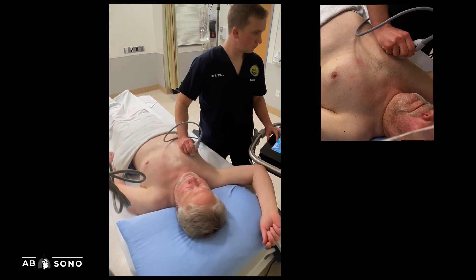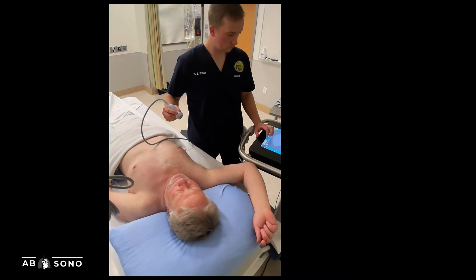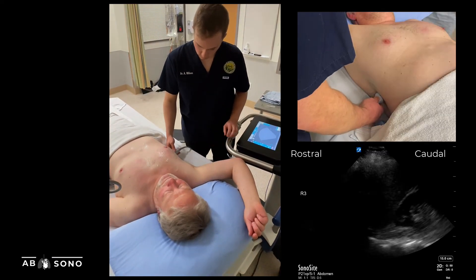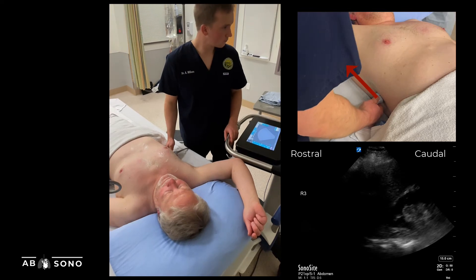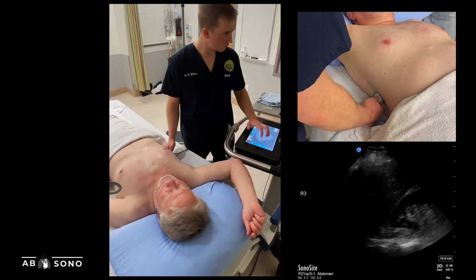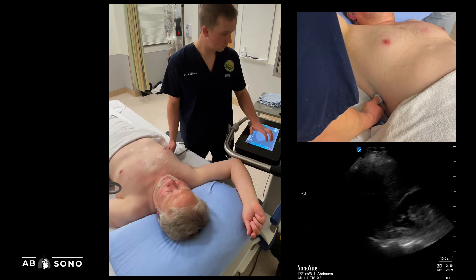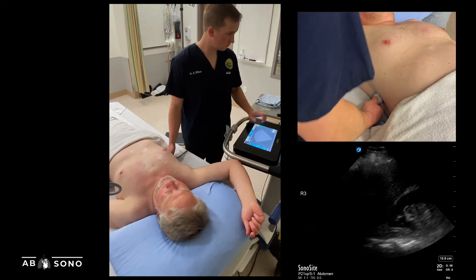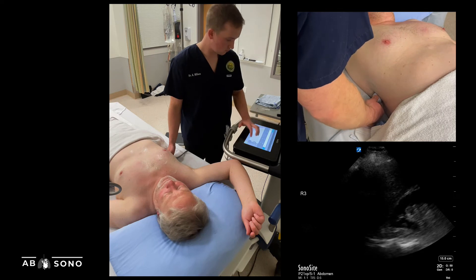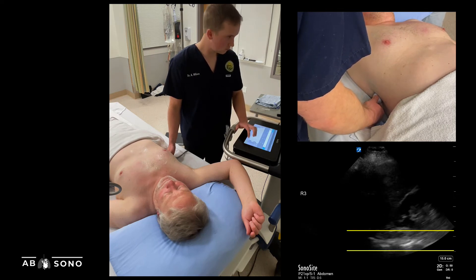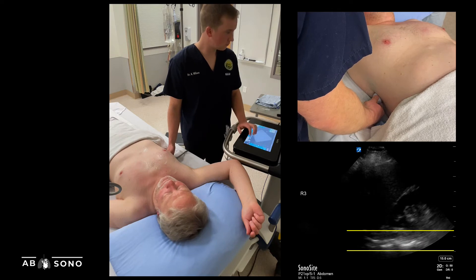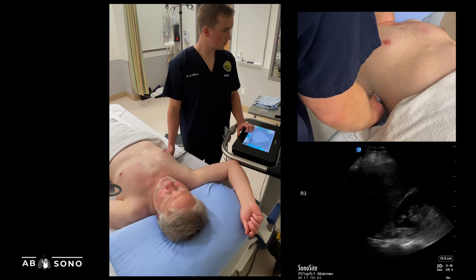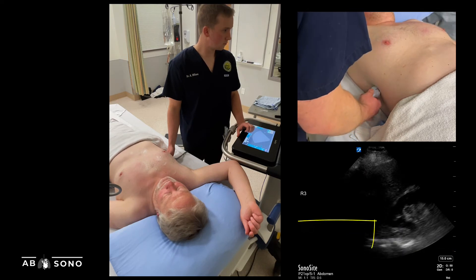To obtain images of R3 and L3, place the probe in the mid-axillary line at the costophrenic angle with the probe marker dot pointing cephalad. The depth should be adjusted to visualize the costophrenic angle in the far field; 13 to 16 centimeters is a good place to start, but often needs to be adjusted based on body habitus. In patients with consolidation and pleural effusion with a positive spine sign, the vertebral bodies are a good internal landmark. They should be the deepest structure seen in the far field. Note that in patients with well-aerated lung and no effusion, you will not see the thoracic spine.